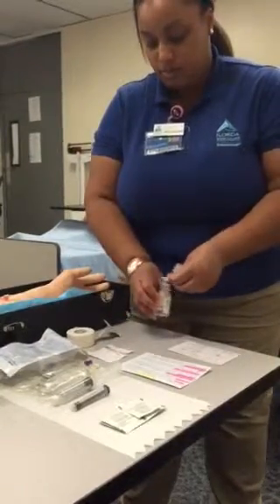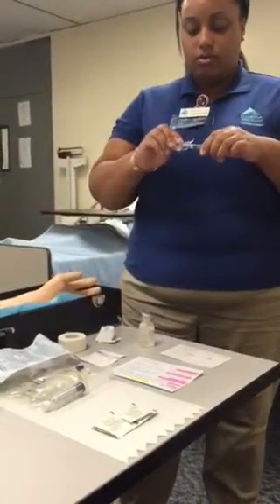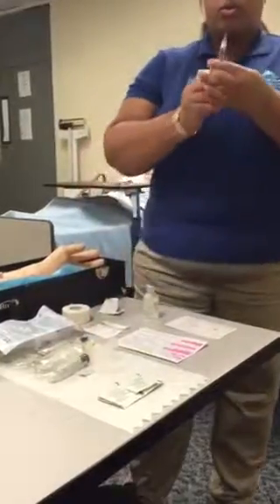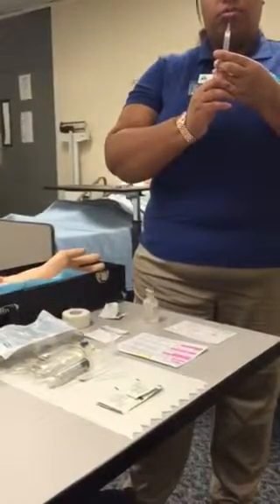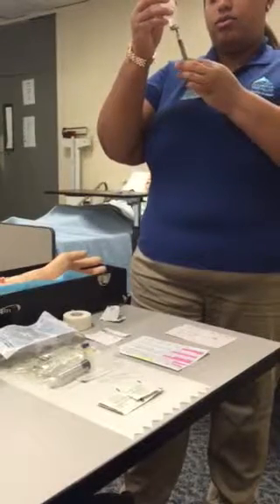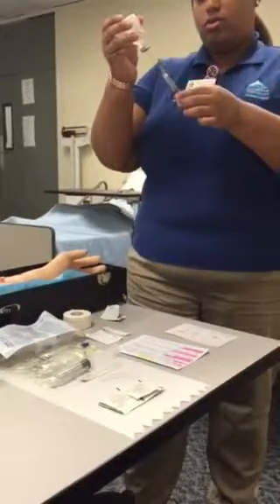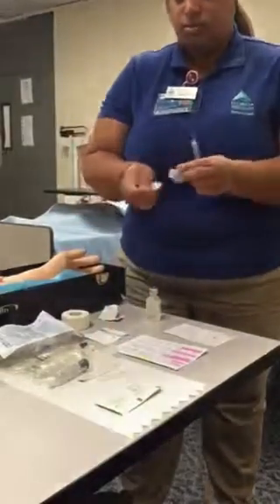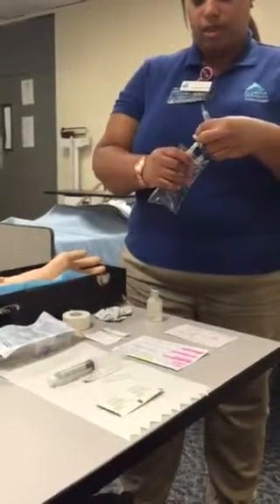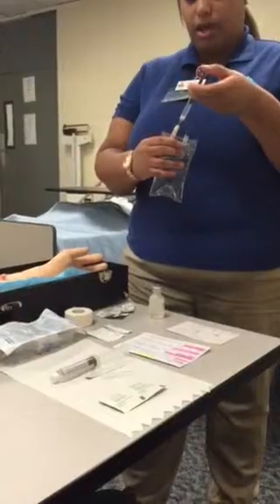Wipe the bottle, let it dry, connect the needle, uncap the needle, withdraw 2 mLs of air, insert into bottle, insert air, withdraw medication 2 mLs, clean mini bag, insert needle cautiously into mini bag, making sure not to perforate bag.